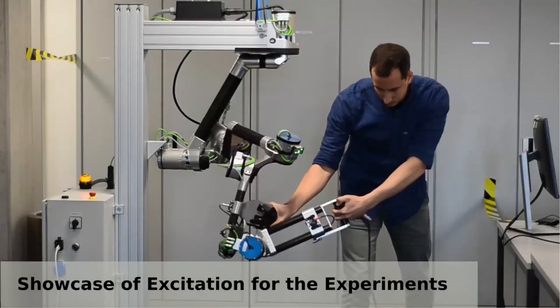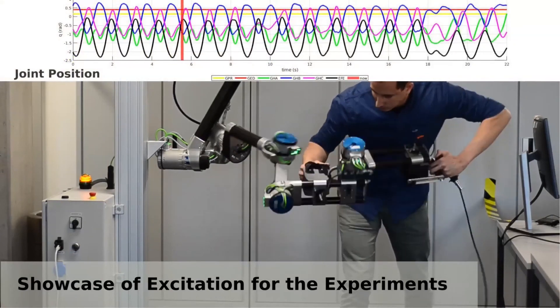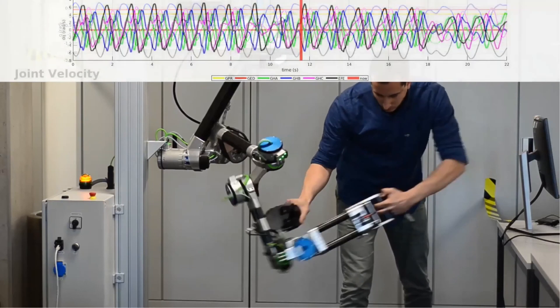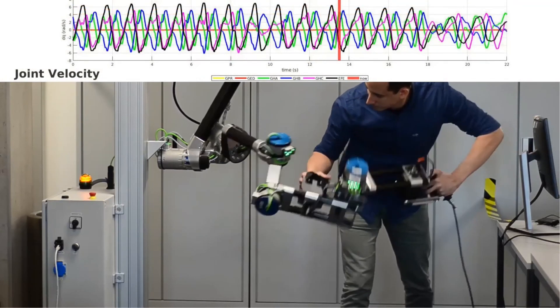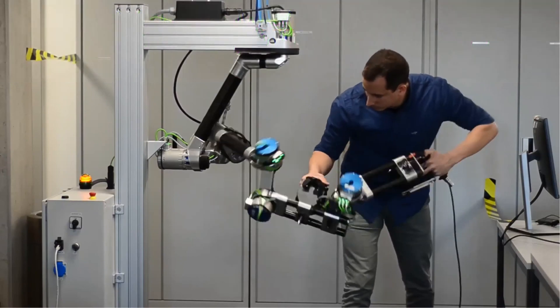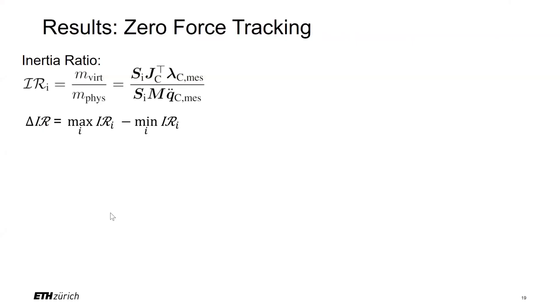To assess the performance in interaction force tracking, we chose to look at zero interaction force control only, as this is an often-reported metric. To this end, we excited the robot in the demonstrated way. The trajectories were chosen such that the four distal joints are moving with comparable range of motion. As already mentioned, we could demonstrate that gravity, Coriolis and centrifugal terms of the robot can be compensated well with a feed-forward term. The main expected advantage of the feedback controller is to reduce the undesired forces felt due to the inertia of the robot. Therefore, we choose the inertia ratio as a metric to evaluate the performance of our controller.